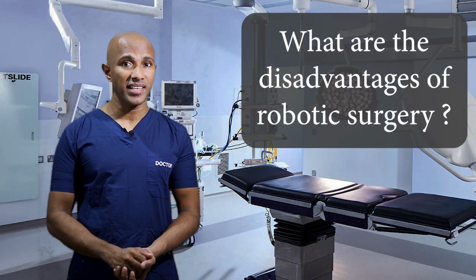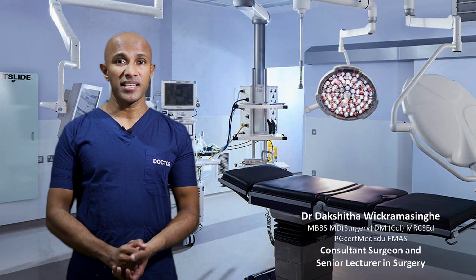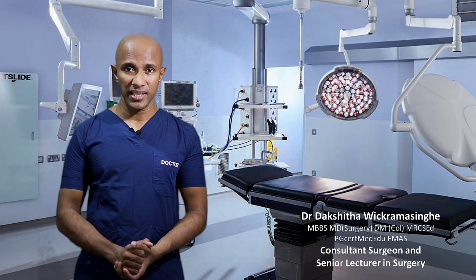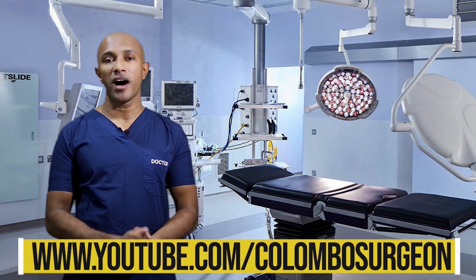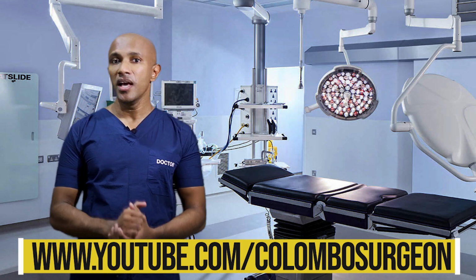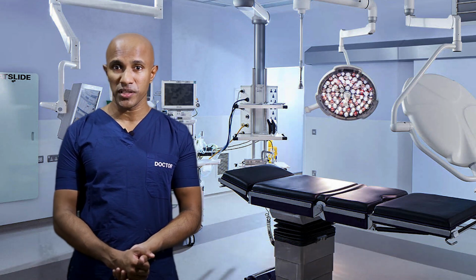Although robotic surgery has many advantages, there are several disadvantages. One of the main disadvantages is the cost. A surgical robot is very costly. In addition, there are instruments and parts that must be replaced after each surgery, which add to the cost. This cost leads us to the next disadvantage, which is availability of these robots.